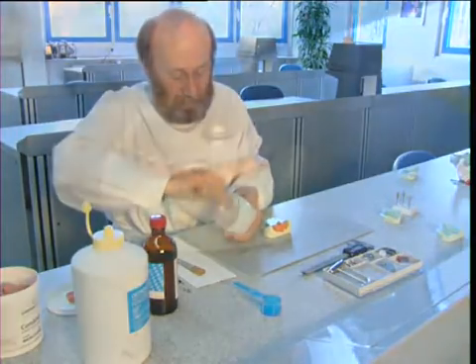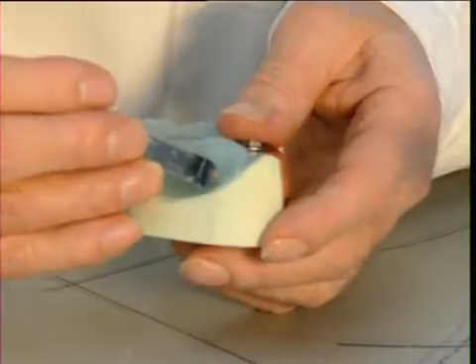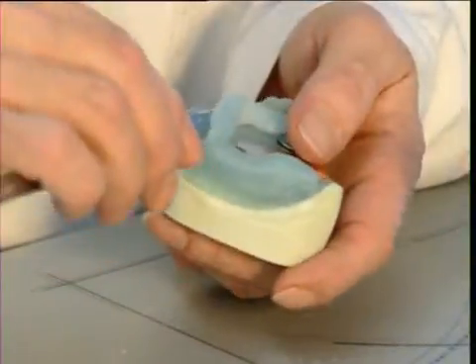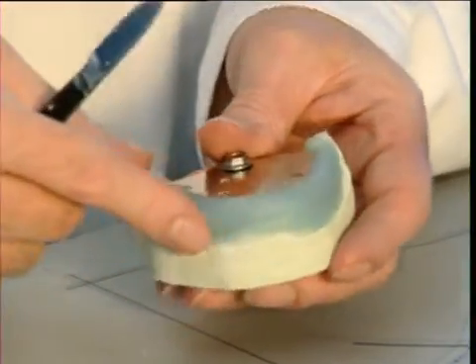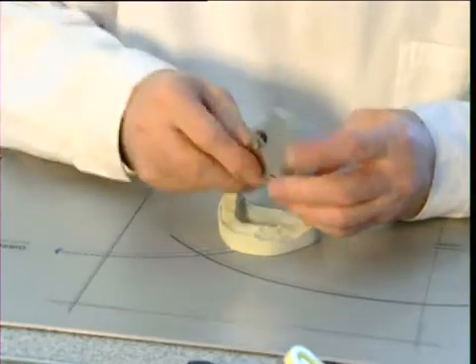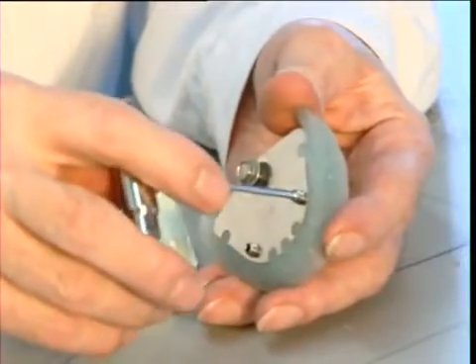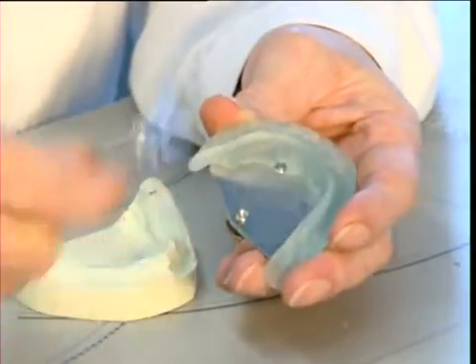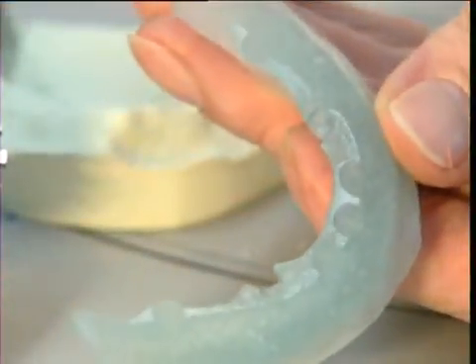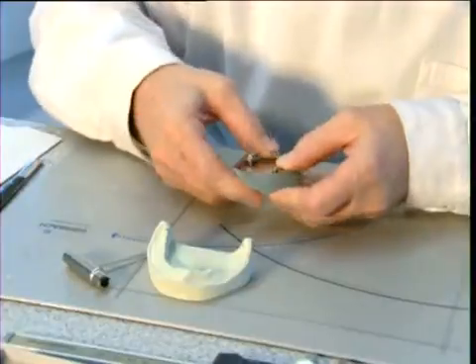Attach the lower tracing plate to the functional tray with Ostron 100. The top surface of the plate must be exposed. Once cured, the entire assembly is removed from the model. To ensure that they can be repositioned properly, loosen the two grub screws and separate the plate from the lower tray. Clean the tray and reposition the tracing plate.